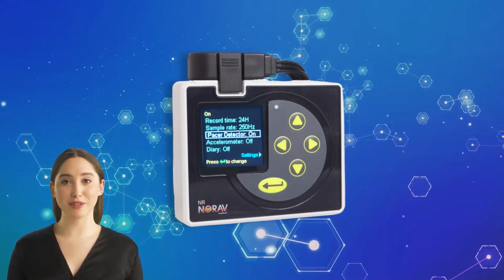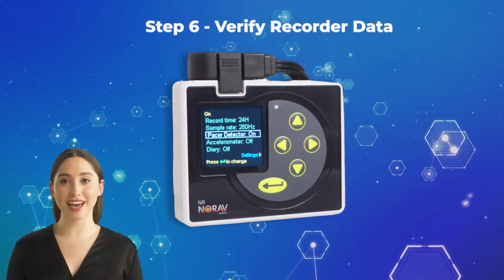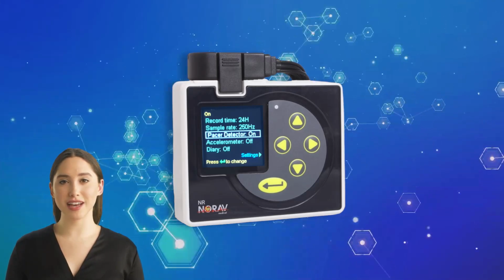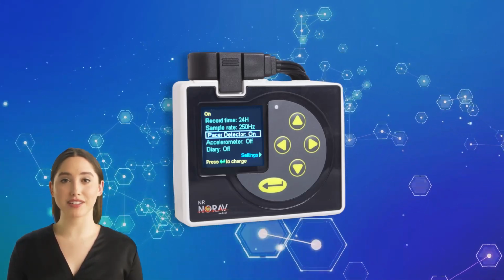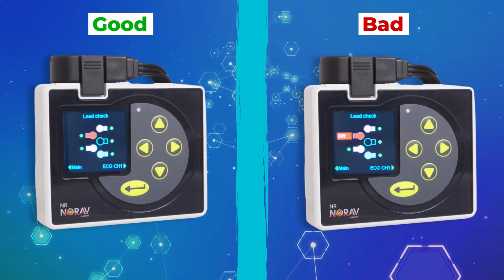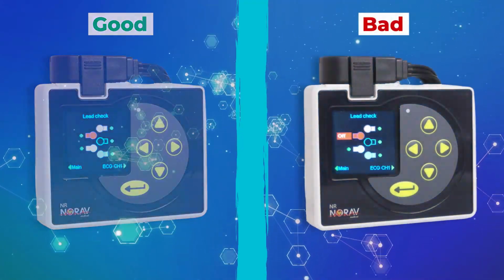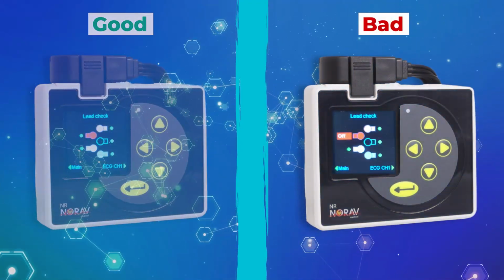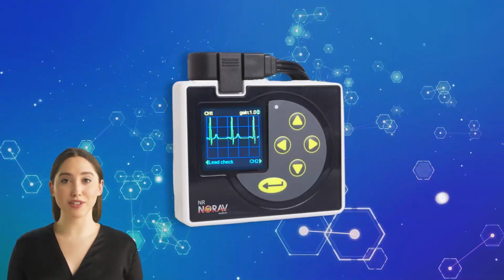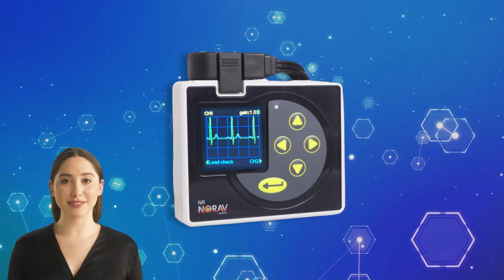After you have initiated the recording, you need to verify recorder data for accuracy. Review the data uploaded to the recorder, such as patient information, recording duration limit, internal clock settings, pacemaker detection, and so on. Verify lead connection quality on the recorder screen. Green dots beside lead pictograms indicate functional leads, while an off message requires closer inspection of that lead. Assess the quality of the ECG traces on the recorder screen. Any abnormalities require electrode or recorder adjustments.